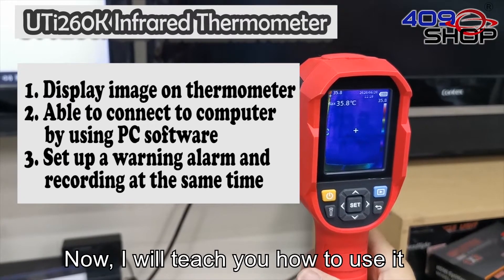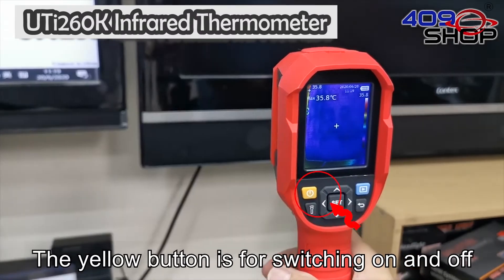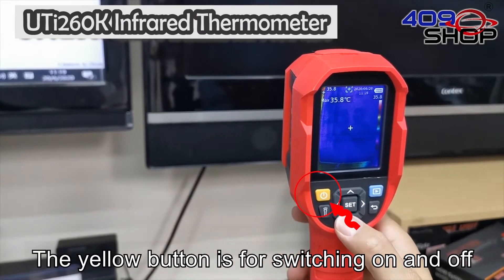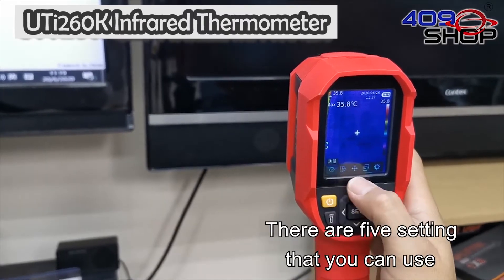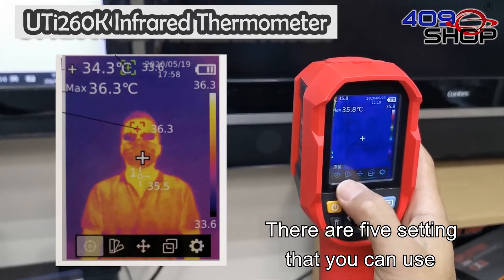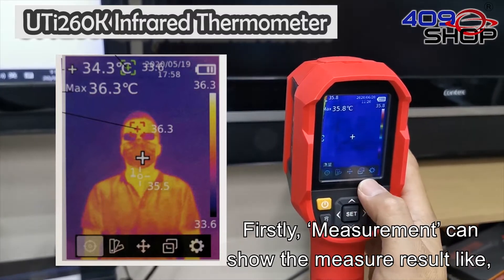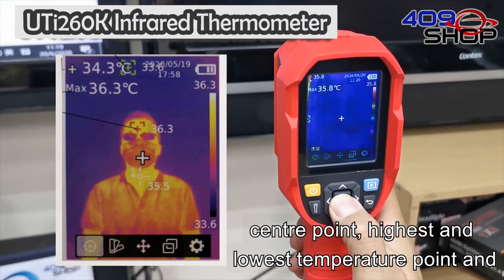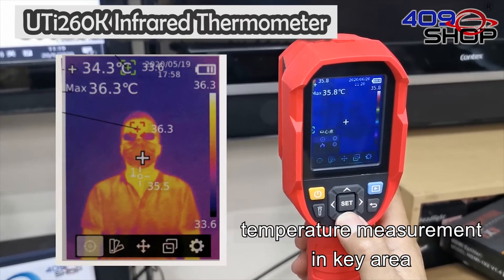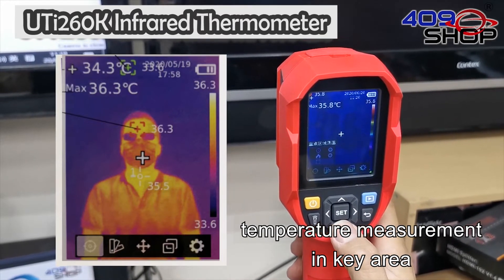Now I will teach you how to use it. The yellow button is for switching on and off. For the set button, there are five settings that you can use. Firstly, measurement can show the measured results like the central point, highest and lowest temperature point, and temperature measurement in a key area.